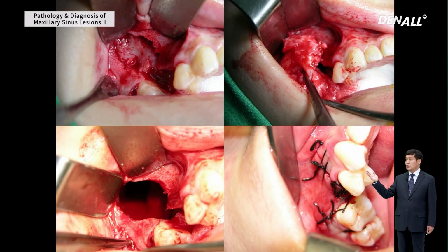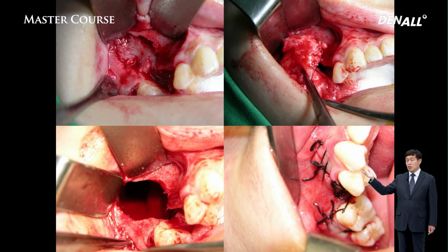At the time of surgery, a lateral approach was done to remove the cyst. On the lateral side, there's no bone, but this is a young patient. Therefore, I just did closure. We can do a bone graft later if necessary. This was how the surgery was done.